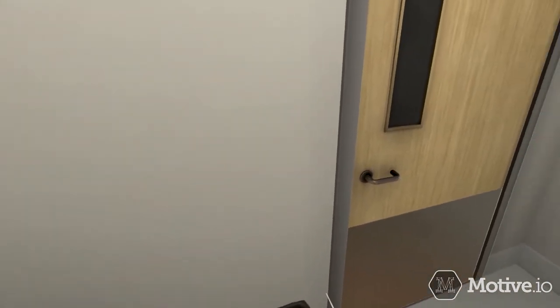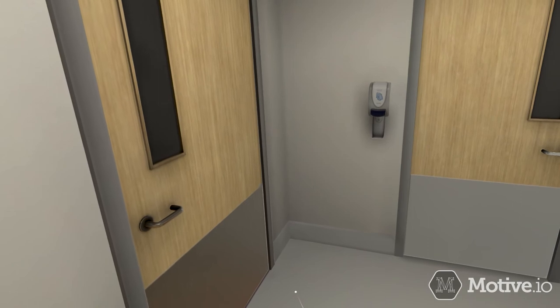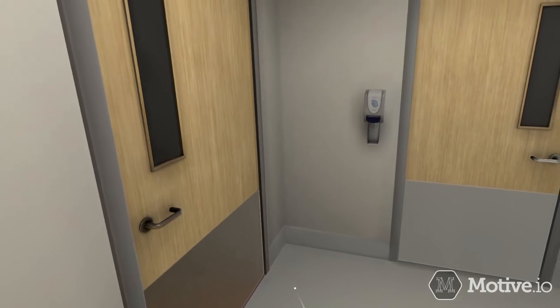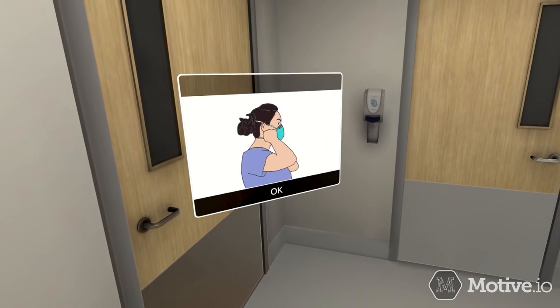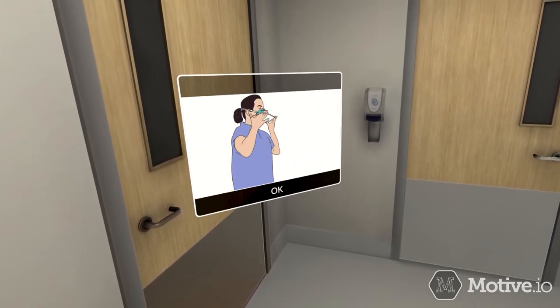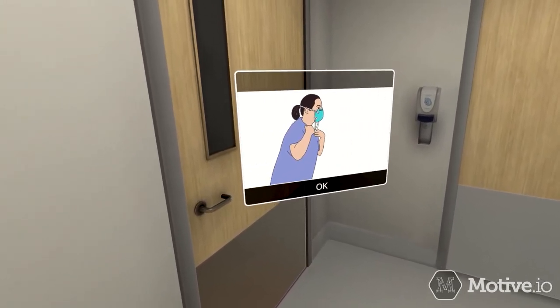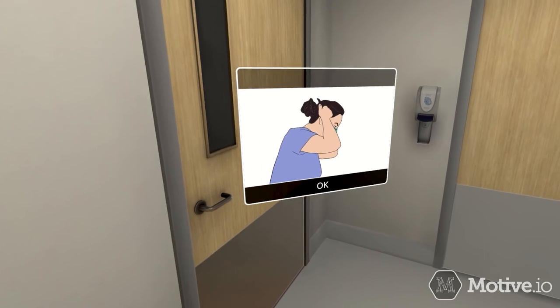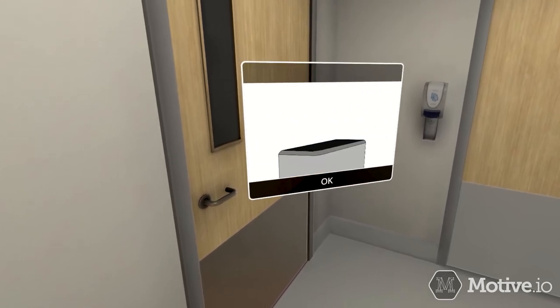Doff the N95 respirator. Do not touch the front of the mask. Grasp the bottom strap from behind your head and pull it forward over your head. Lean forward, bending at the waist, to allow the mask to fall away from your face. Grasp the top strap from behind your head, pull it forward, and discard.